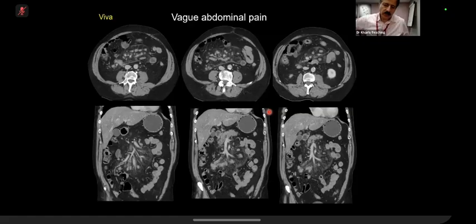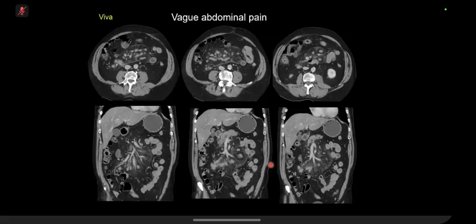Now, that's very good. Mesenteric panniculitis is a very important exam case. Why? The current concept is that we now call it IgG4 related disease. So there is a spectrum, and in Radiographics there are a few good articles.